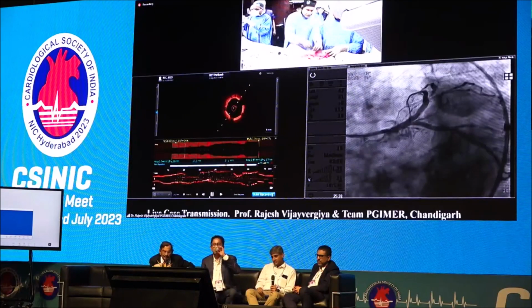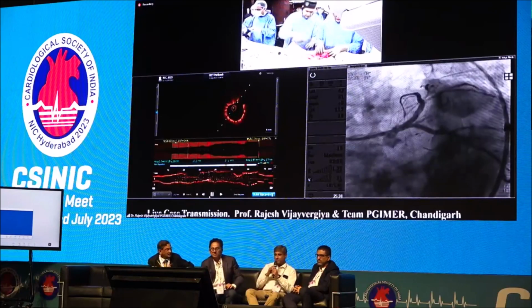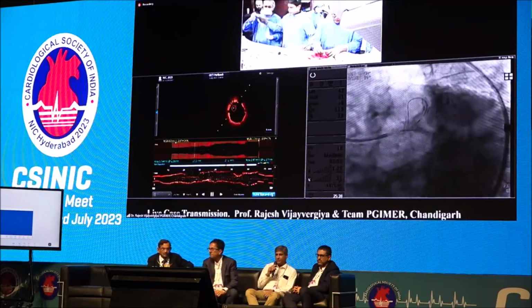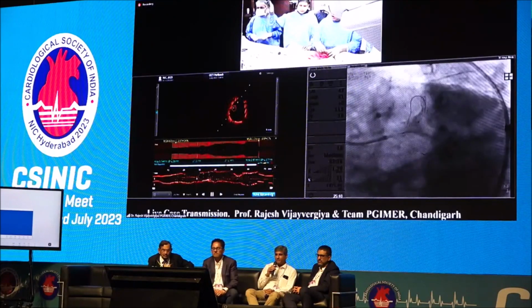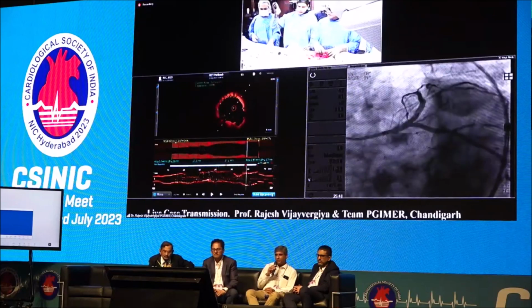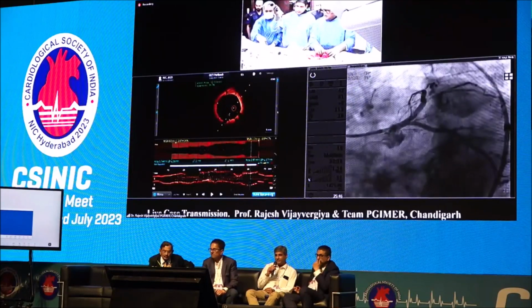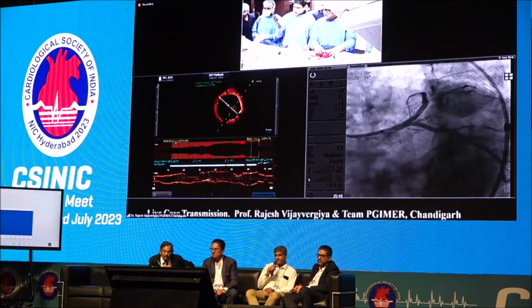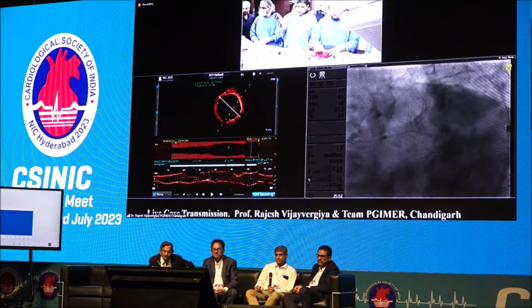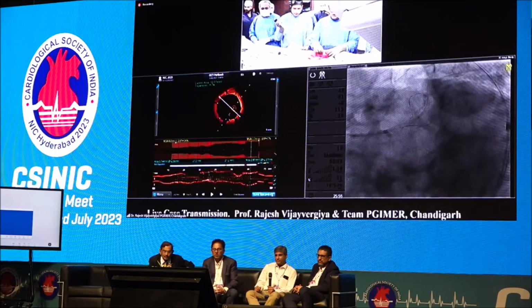Okay, very acceptable result. So according to your OCT right now, what is the size you would be using for the left main POT? Nikhil, can you show the size of the left main? How much is the size? Is it 4.5 or 5? Let us reassess it. It's 4.5, so it's going to be a 4.5 POT.